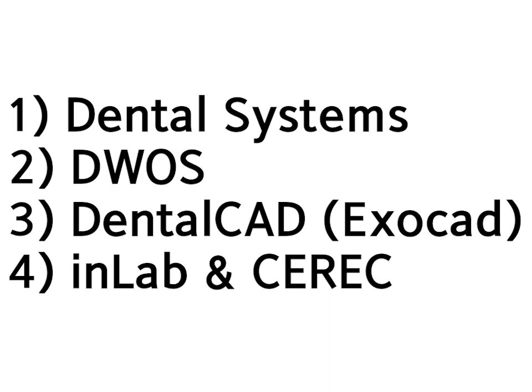The next one is the inLab and CEREC. Sirona has three design softwares: the software inLab for dental labs, the simplified software CEREC for dentists, which is coupled to an intraoral scanner, and the premium software CEREC, which is a software for dentists but with almost identical features as the inLab version.